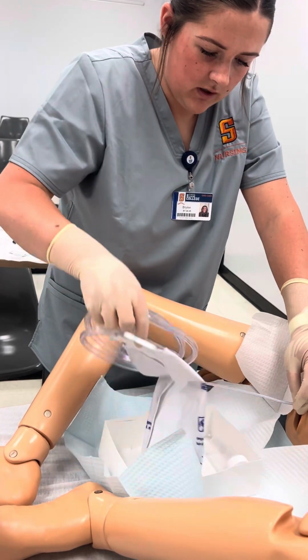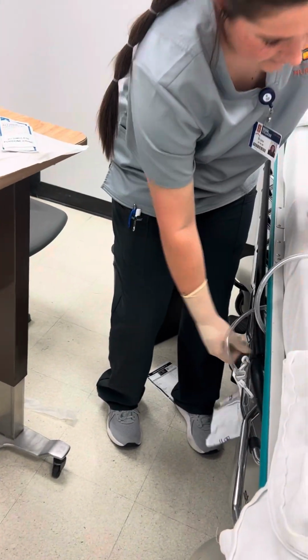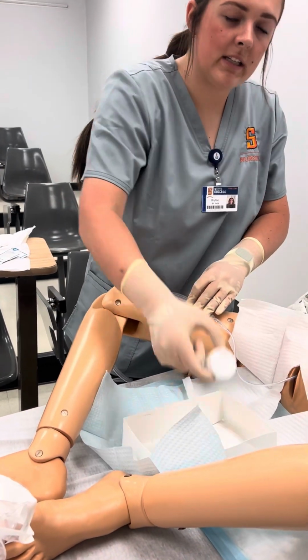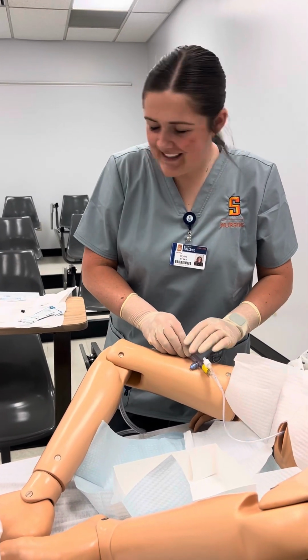And now what I'm gonna do is I am just going to take this out and set it up right here on the side of the bed, not anywhere where the bed will move, on a stable part of the bed. And now I do not have to be sterile anymore. And then this is where I would collect my sterile specimen. We do not have to do that today, but it would be labeled and sent to the lab.